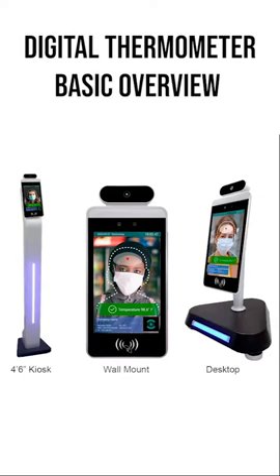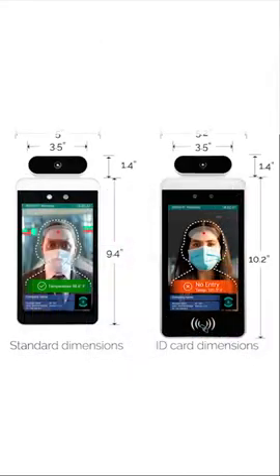Welcome to the digital thermometer basic overview video. In this video, we will go over the basics of setting up your digital thermometer. The dimensions of the digital thermometer are 10.8 inches by 5.04 inches.